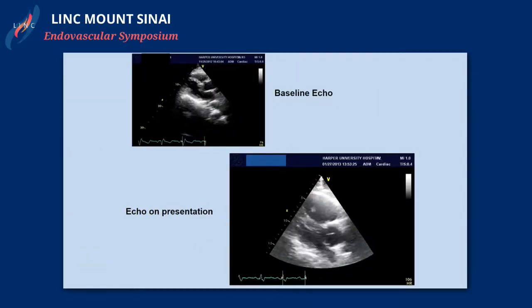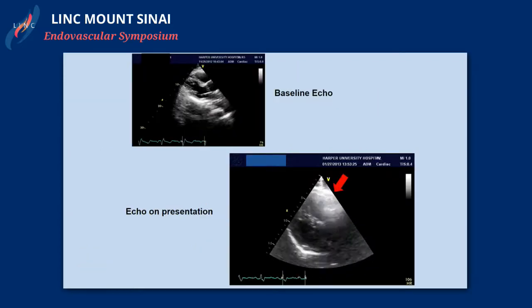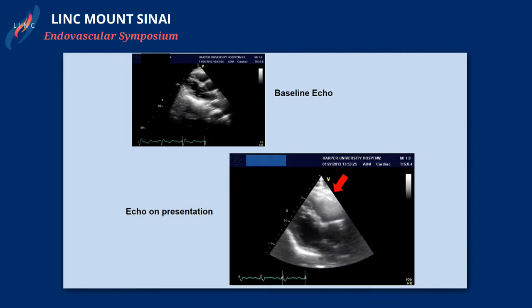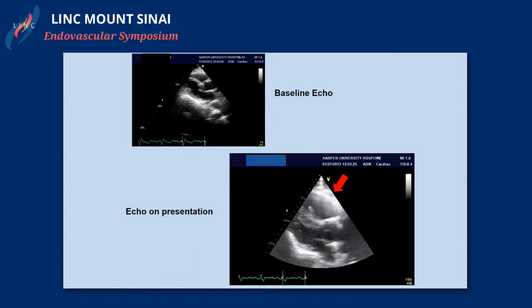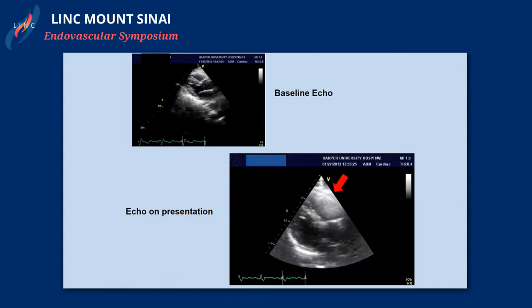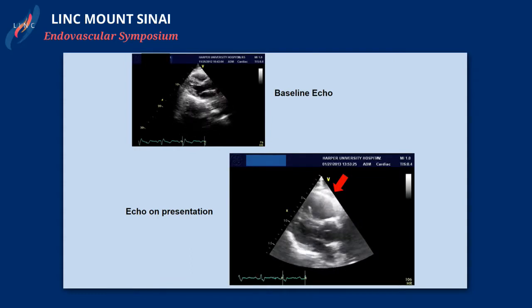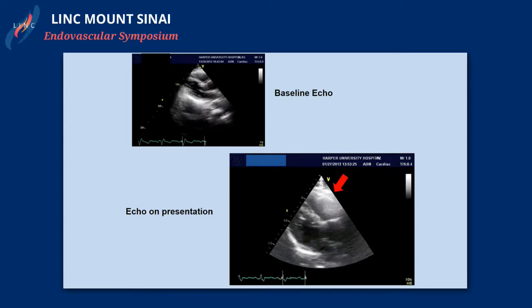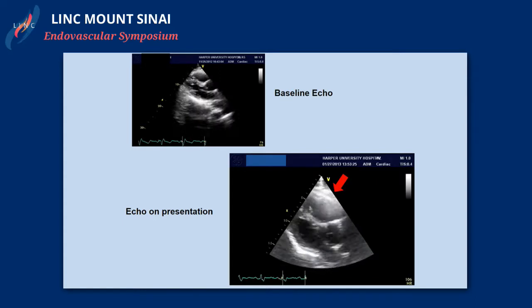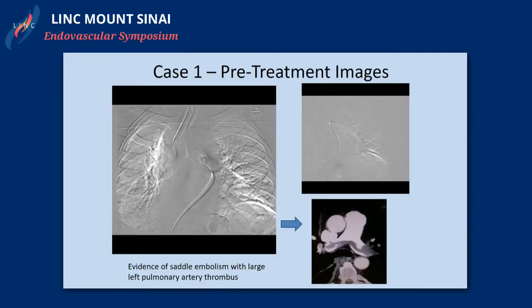This is the echocardiogram at baseline. The patient had an echo at our institute before, showing an RV that functioned properly. Below, you see an echocardiogram in the ER showing a blown-out right ventricle. The other images showed a McConnell's sign that you see commonly in massive and sub-massive PE.